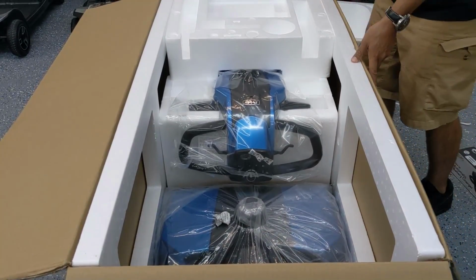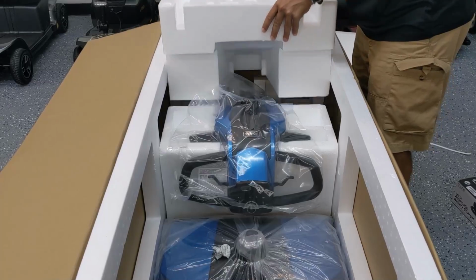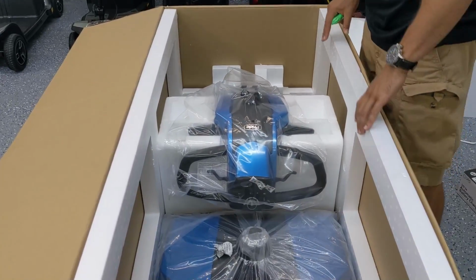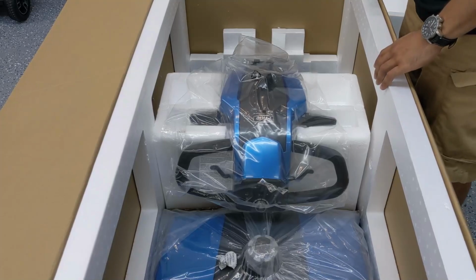You want to keep the styrofoam molding for at least 5 days. That way, if you do decide you want to take the scooter back for whatever reason or return it, you can send it back in the factory packaging that it came in.